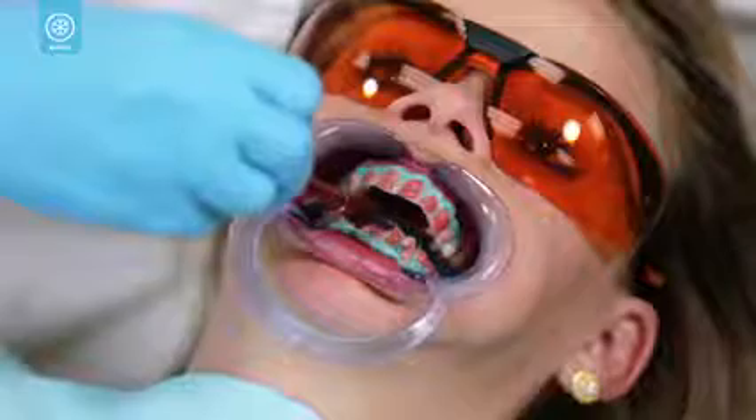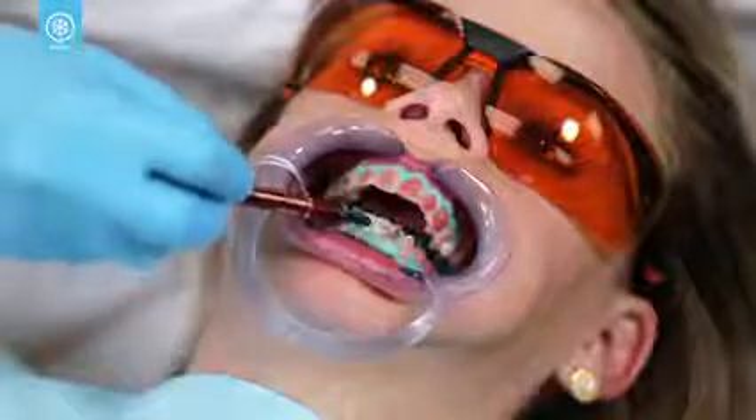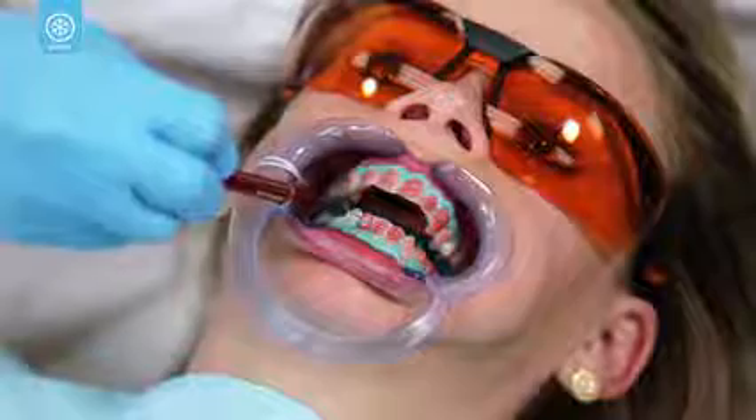The gel will remain on your teeth for about 20 minutes. After the 20-minute whitening period, the Opalescence Boost whitening gel will be suctioned off your teeth. Your dental professional will then evaluate the shade change of your teeth. If you need additional treatments to achieve your desired results, your dental professional will apply a second application of Opalescence Boost.